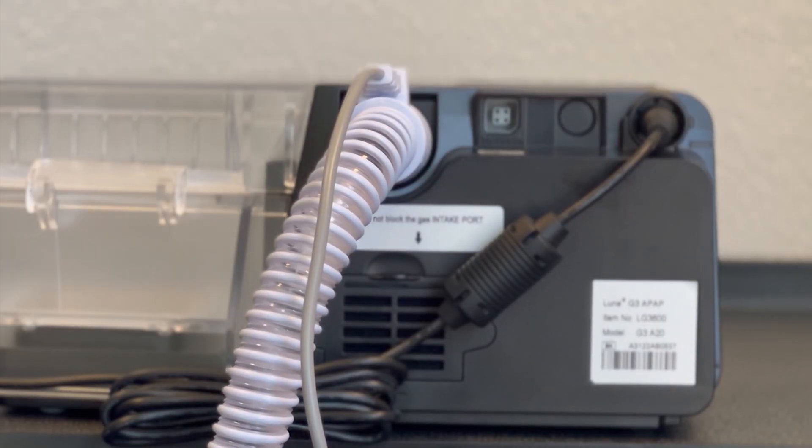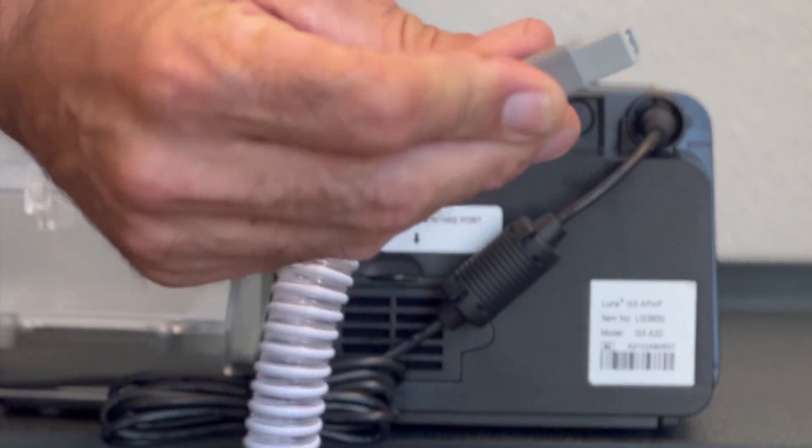If you have been prescribed heated tubing, you take this cord.